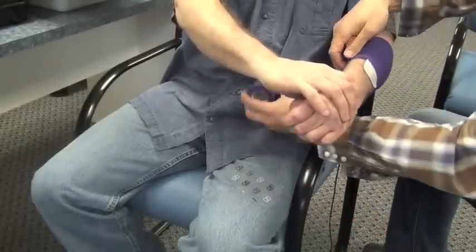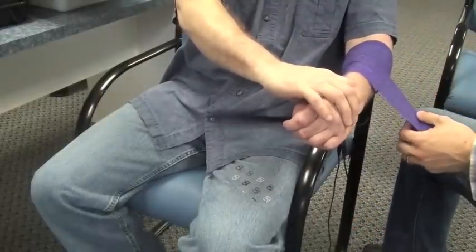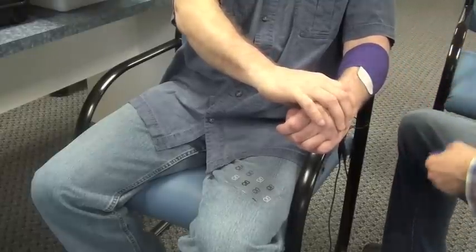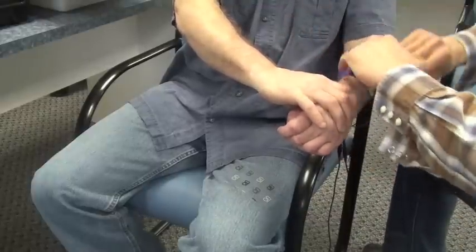Once you have determined that you are happy with the EMG electrode placement on the flexors, as well as the electrical stimulation electrode placement on the extensors, consider Coban or some other type of wrapping mechanism to protect the electrodes prior to donning the SaboFlex.